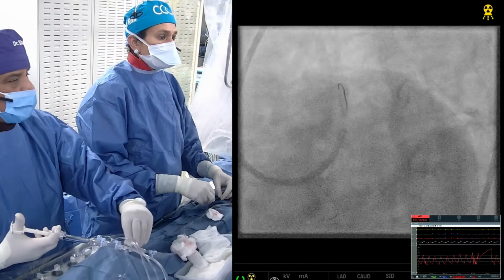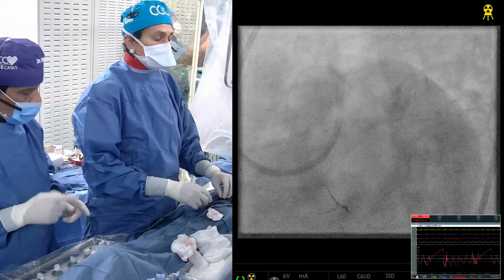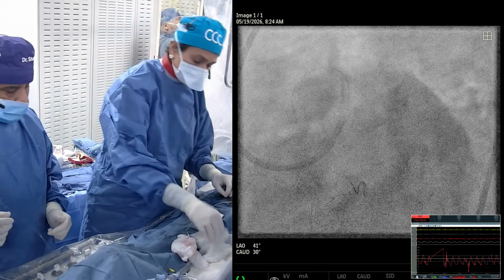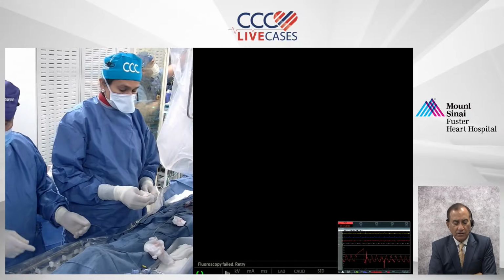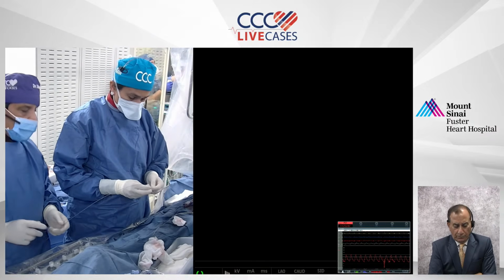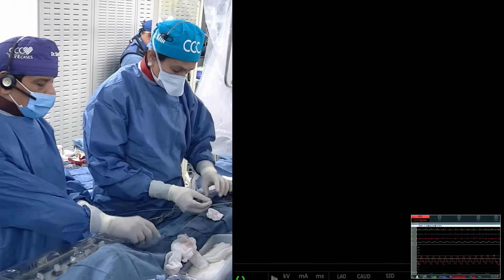And I think this case would have been fine even with 2 burr, but we had the 1.75. You need cutting balloon. What do you need now? Imaging. Oh, okay. You also mentioned it, Samin. Question had been asked, would you consider orbital? Yeah, this is a reasonable case for orbital. Yes, in aorto-ostial, we have published that orbital is not good.